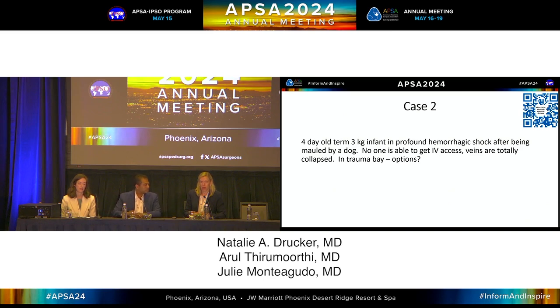So this is a time where we have to think outside of our normal surgeon box. So how many people in this room have put in an umbilical line in the past 5 years? And how many people have put in an IO?